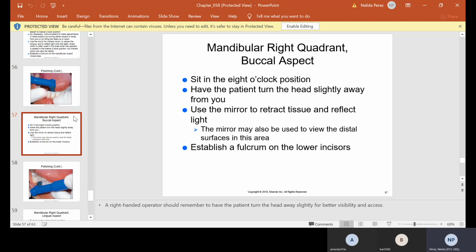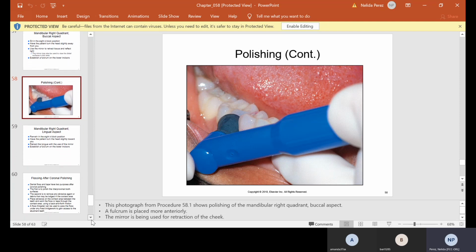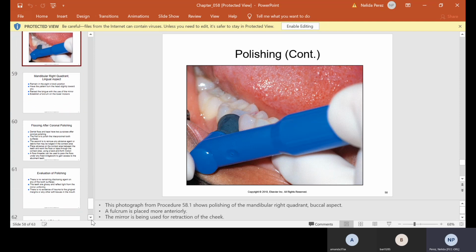reflect light. You're going to use it for indirect or mostly indirect vision, and also, again, for retraction. The mirror may also be used to view the distal surfaces in this area. Establish a fulcrum on the lower incisors, and here's what it looks like. Okay, so that's the buccal aspect.